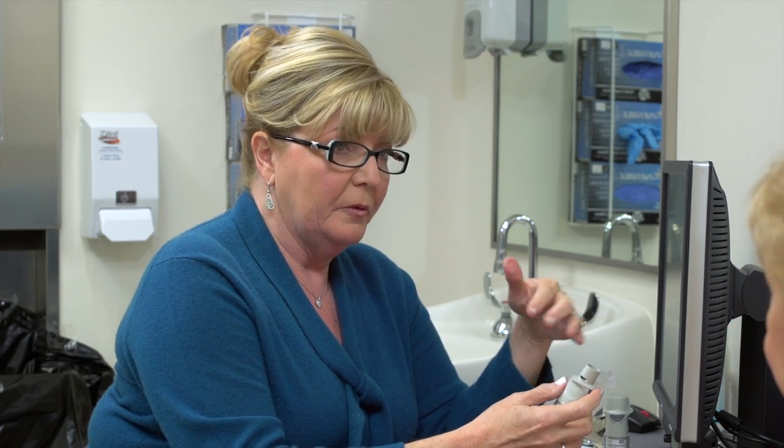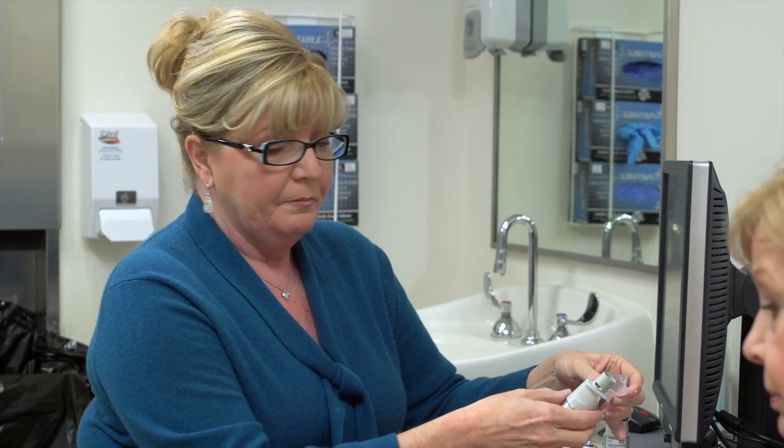To prime the device, remove the mouthpiece cover while holding the inhaler away from your face and not in the direction of your eyes, because you don't want to get any medication in your eyes. You might accidentally trigger it and a mist would come out. This medication may be irritating if it comes in direct contact with the eyes. If a patient accidentally depresses the gray button when opening the cap, the spray may be unintentionally discharged toward the eyes. It is good practice to instruct patients to open the cap while pointing the device away from their face.